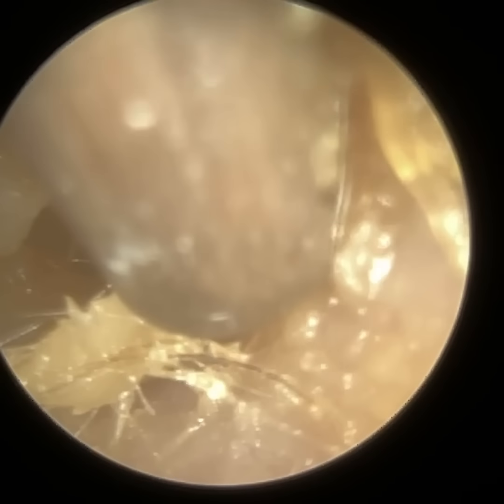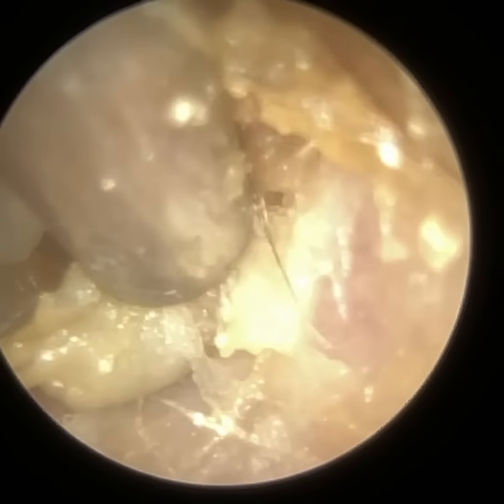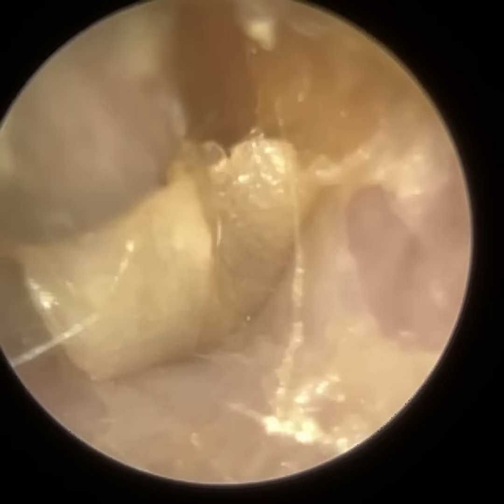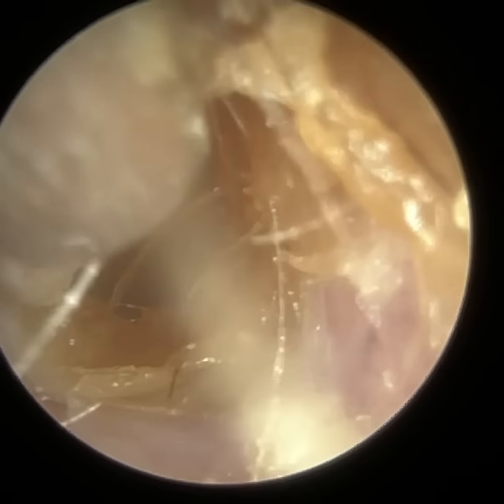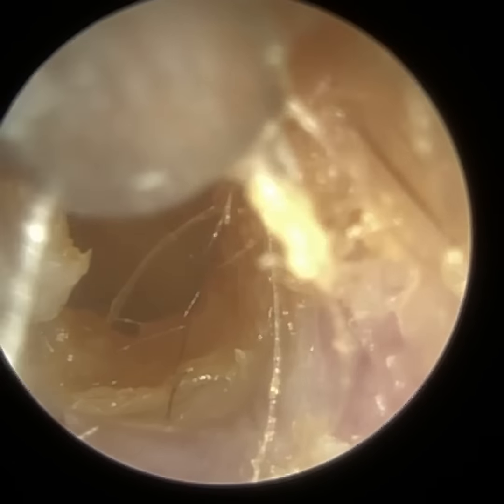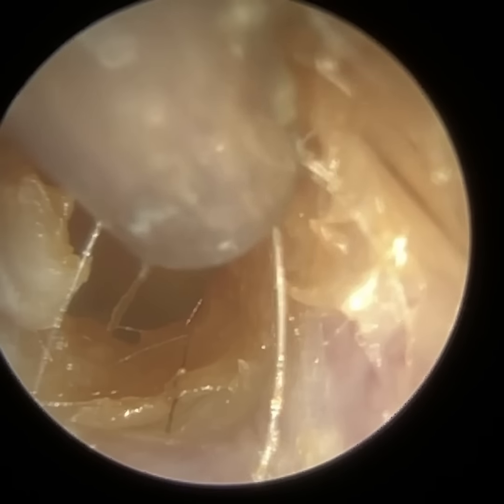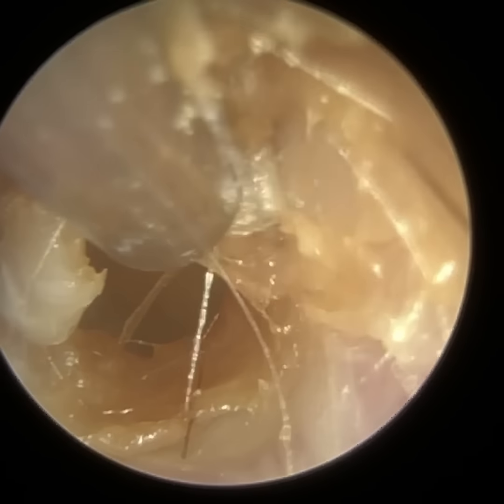With regards to the inner 2/3 of the ear canal, the osseous portion, the bony portion, you only have this epidermis layer of skin lining the ear canal, and directly underneath you have the bone. And so the skin that lines the inner 2/3 of the ear canal is probably less than 0.1 millimeters in thickness. However, on the outer third of the ear canal, the cartilaginous portion, the skin has 3 layers.